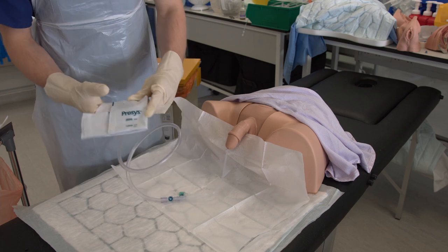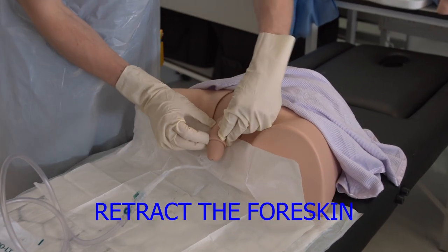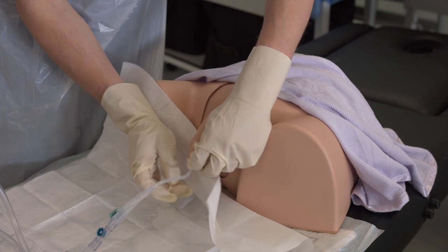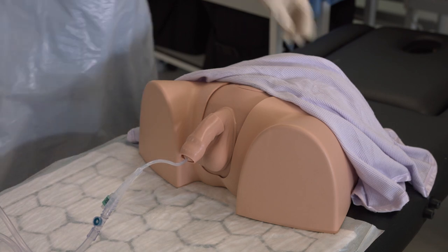Open out the catheter bag and place it on the bed. Then always remember to retract the foreskin when finished. Remove the patient drape and cover up the patient.